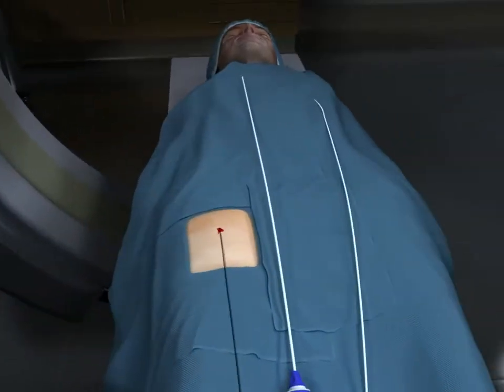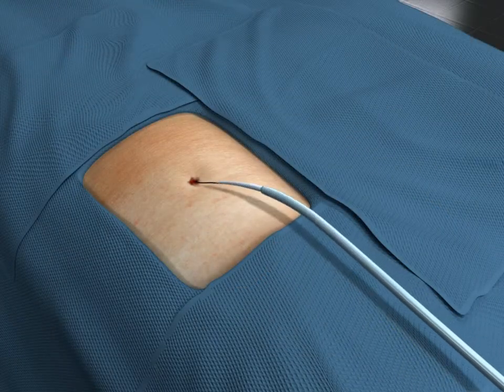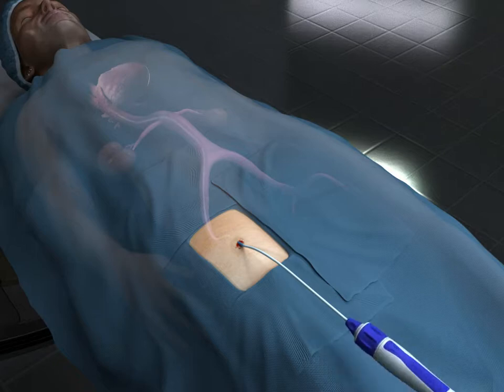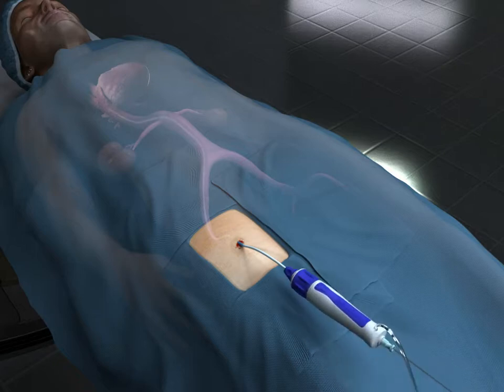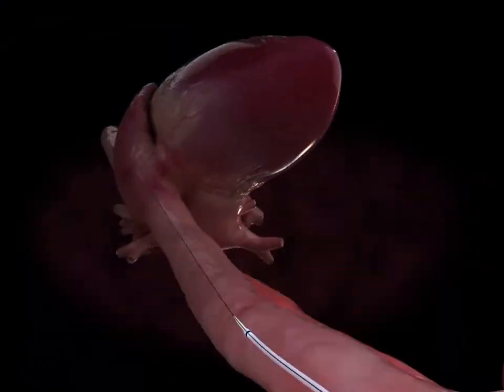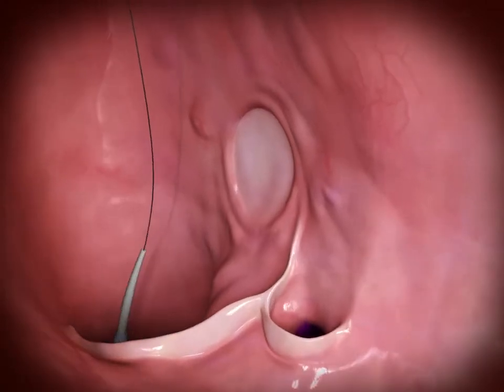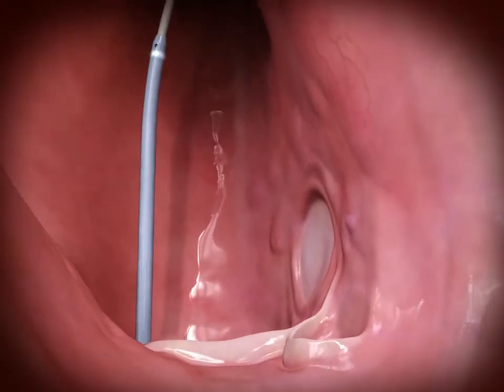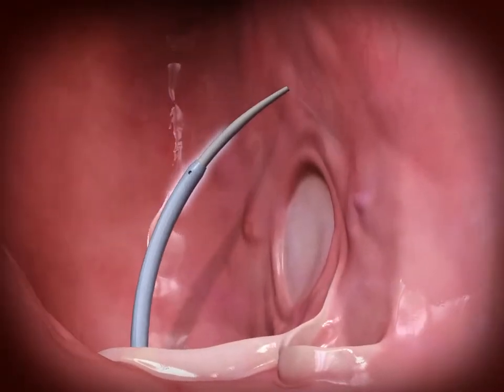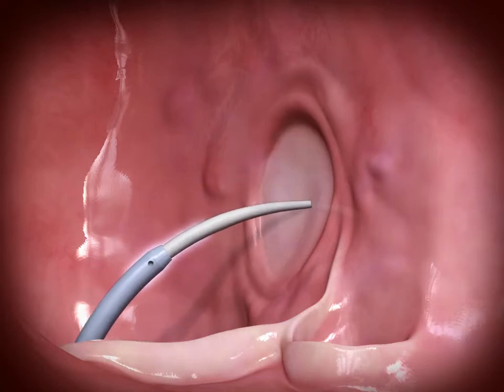The HeartSpan has 74 centimeters of usable length, is compatible with a 98 centimeter transeptal needle, and has a shaft body that is smooth and lubricious for easy insertion. The radiopaque marker band enhances visibility.